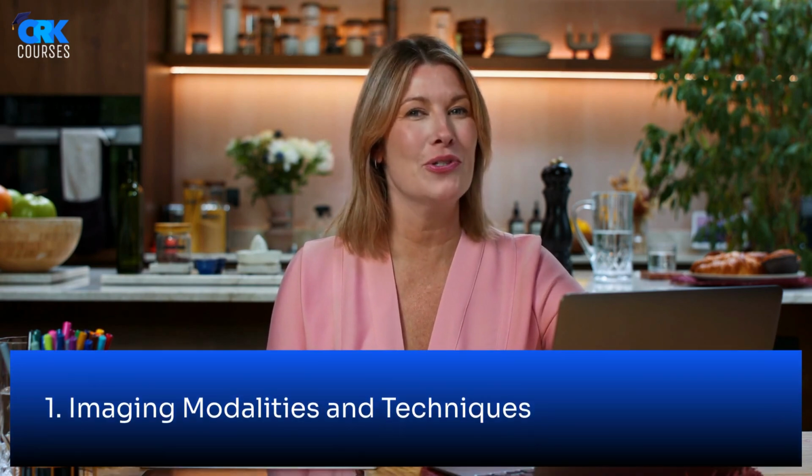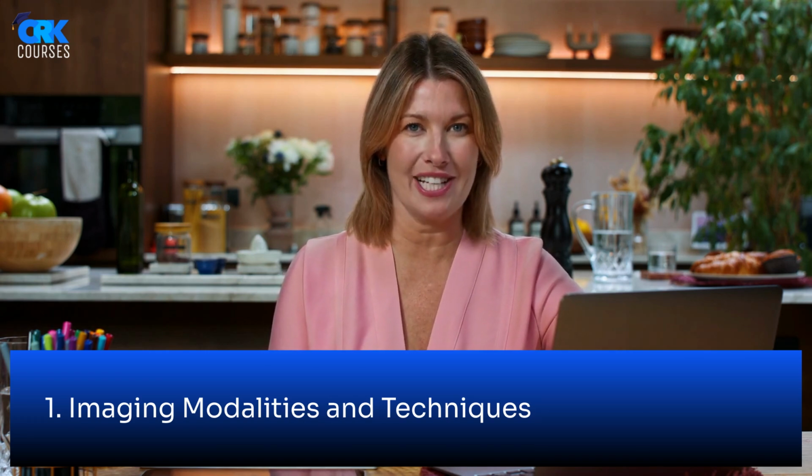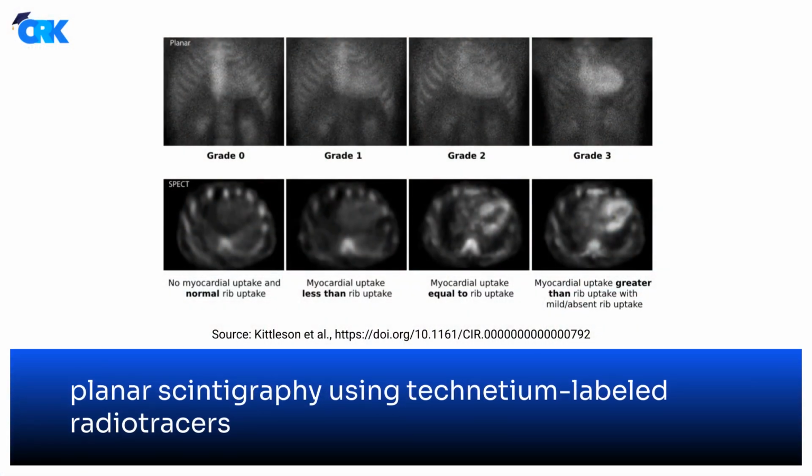Now let's take a closer look at the imaging techniques commonly used in the evaluation of cardiac amyloidosis. A range of imaging modalities is available, each offering unique insights and diagnostic strengths. One of the most widely accessible is planar scintigraphy using technetium-labeled radiotracers. This technique plays a central role in the non-invasive diagnosis of transthyretin cardiac amyloidosis.